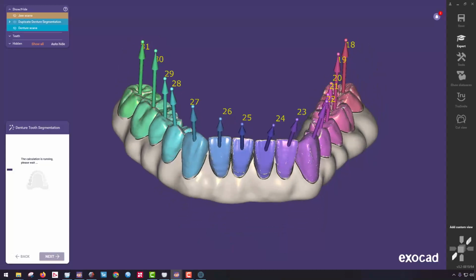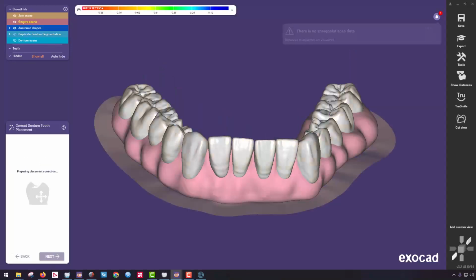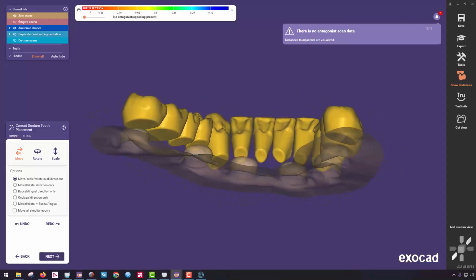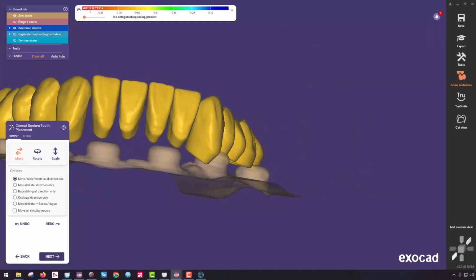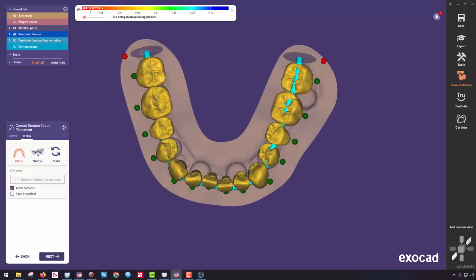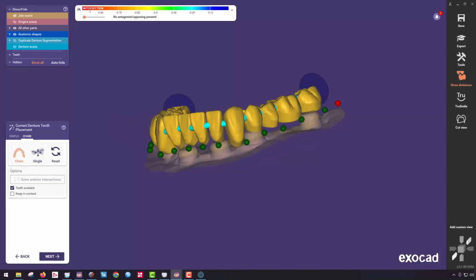Now at this point, we're just going to let the software think while it goes through the calculation. And then it also builds a separate set of teeth and bases. You see right in here, overall, that looks pretty good. And then just as a good measure, I do like to kind of come in here and verify, does this look good? Here's my chain mode. If I wanted to go ahead and use my chain mode, I'm going to leave all of this as default unless I see something that's a glaring error.